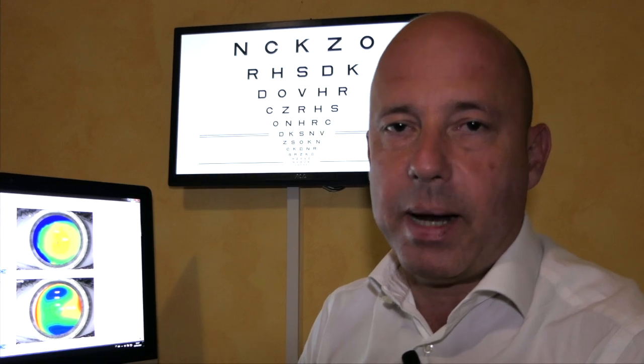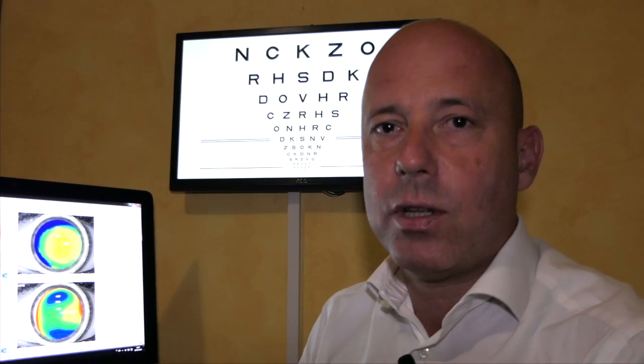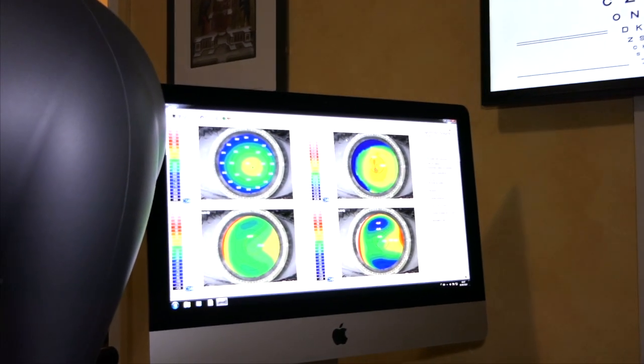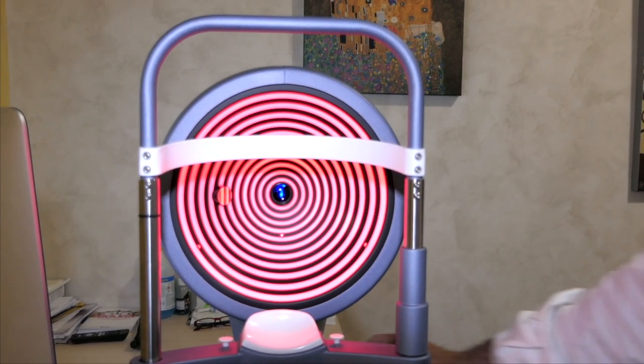The corneal topographer is a machine that manages to encode everything that is transparent. It practically gives us information on the most anterior part of the eye. This is the part we can measure with an instrument equipped with cameras such as the topographer.